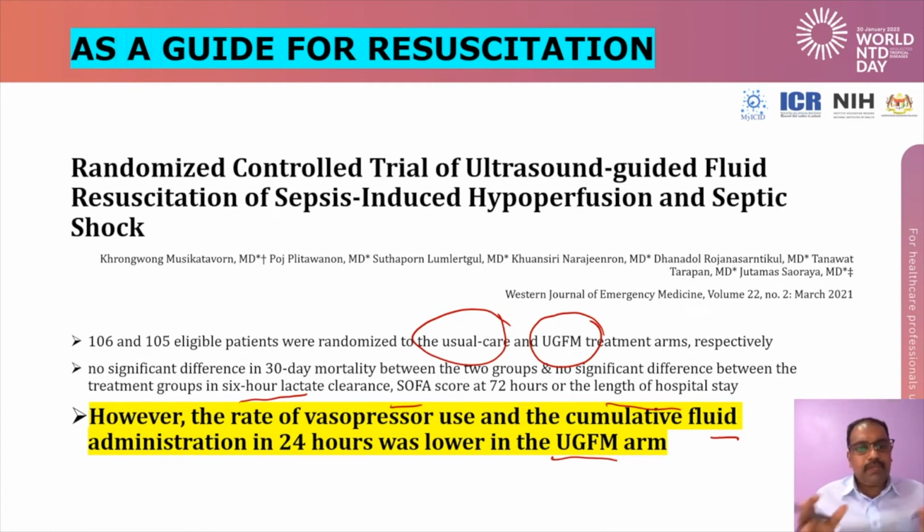So what I'm trying to say here is fluid resuscitation has to be done for a patient, but with ultrasound IVC scan, it may guide you to avoid over resuscitating or under resuscitating a patient.